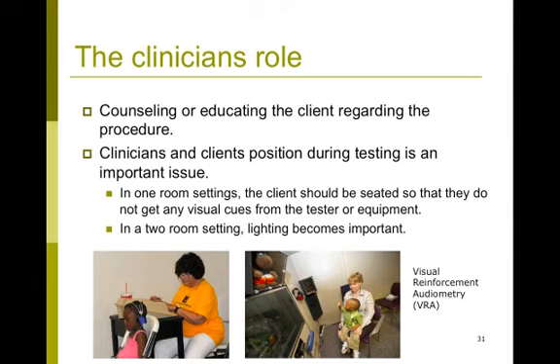Also, depending upon the situation where you're doing this testing, the clinician's and the patient's position would play an important role. In one-room settings, you would have to make sure that the patient does not get any visual cues from the tester or equipment. So you might have the patient seated away from the audiometer and seated at right angles to where the equipment is.